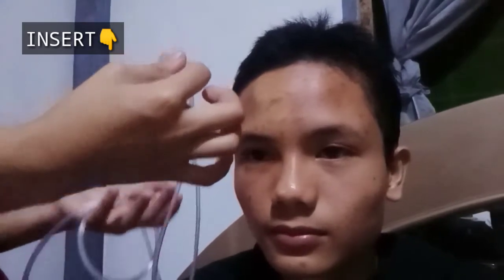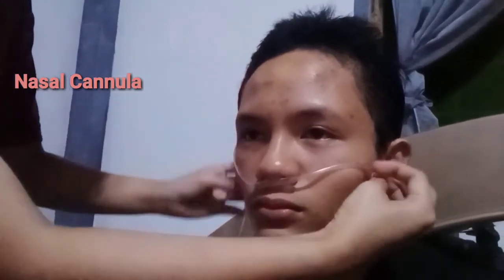For oxygen use, you can either use a mask or a nasal cannula. For the nasal cannula, we put this to the nose and through to the ears, this to both ears, and adjust it for the safety of the patient, so as not to suffocate the patient.